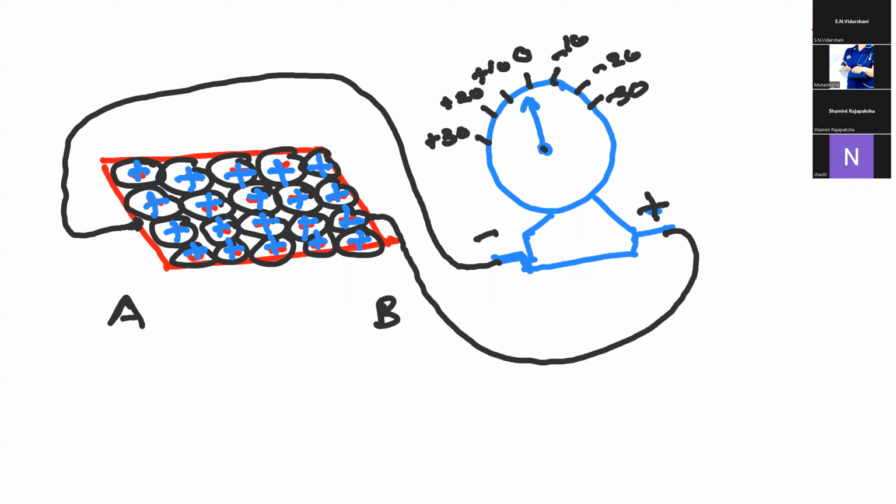Just remember the concept. If you want to, you can draw these pictures. Otherwise, no need to take notes sentence by sentence. I am still taking you to a place, I am still explaining a concept. Right? Now the needle fluctuation became 0.